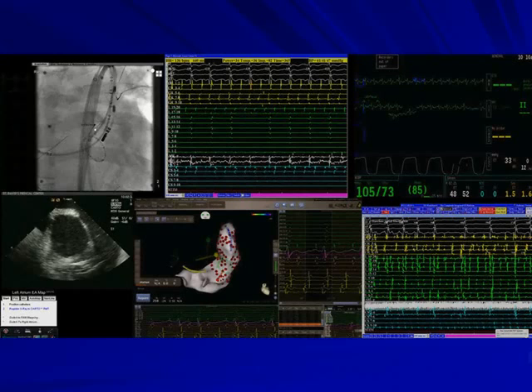And actually goes up past the cardiac silhouette, and then there's a bridging venous structure that connects it to the left SVC. So although you can't see the right atrium over here, there were only three ways to get into the right atrium in this patient.